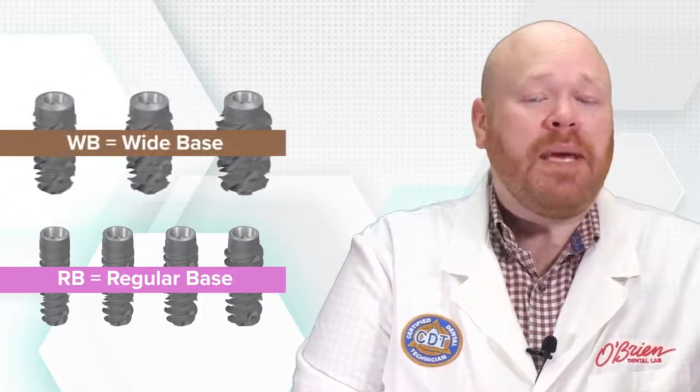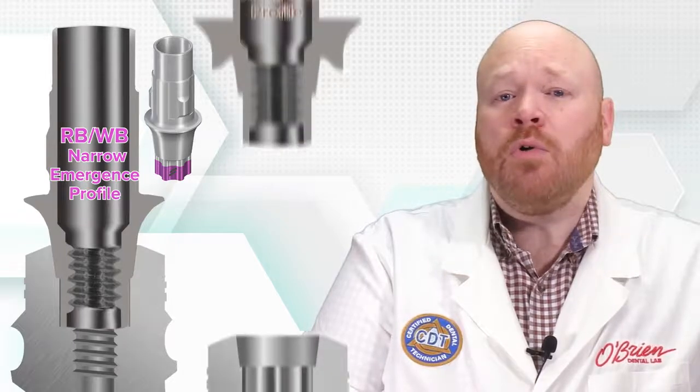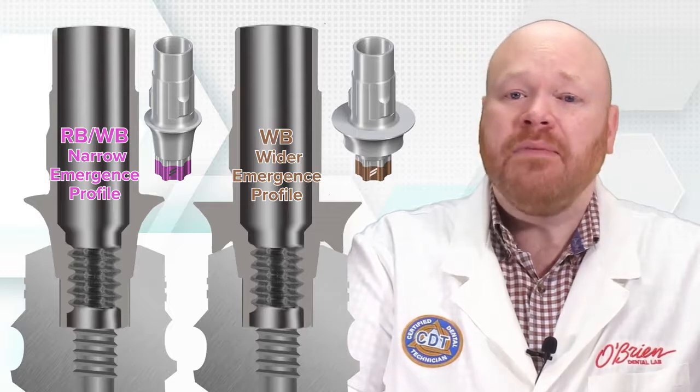For the BLX line, RB is short for regular base and WB is short for wide base. The 3.5 to 4.5 implants are all considered RB, while the 5.0 and above are all considered WB. The components that will work on all of these implants are called RBWB, and they feature a narrow emergence profile at the connection. The components that will only work on the large diameter implants are called WB, and they have a wider emergence that actually rests on top of the implant.